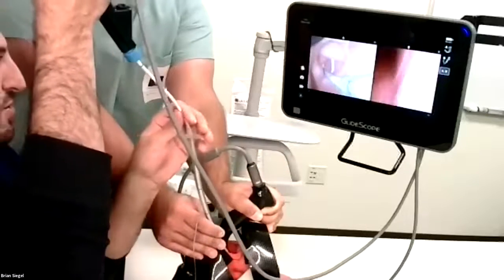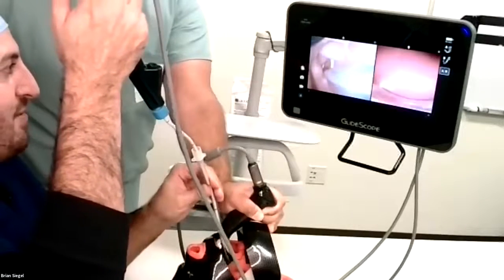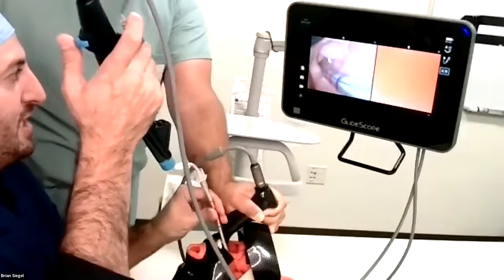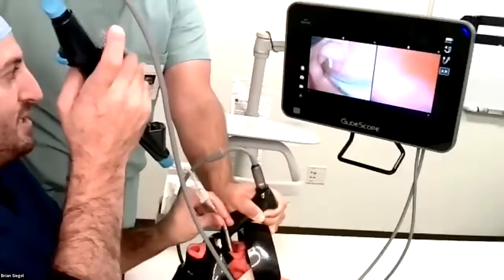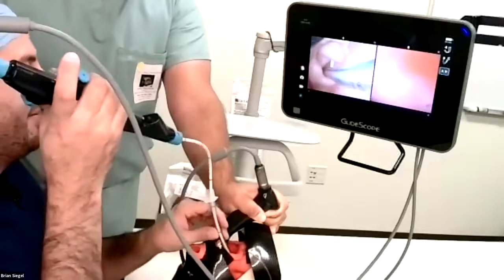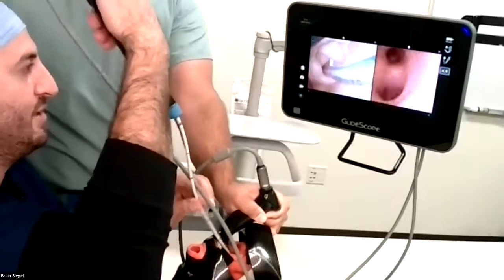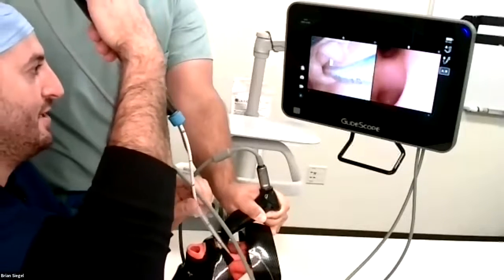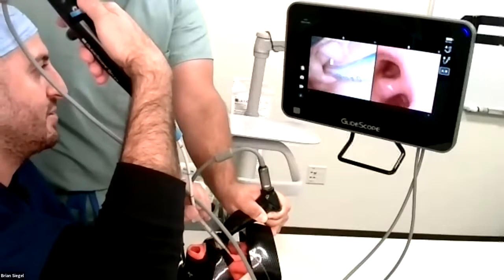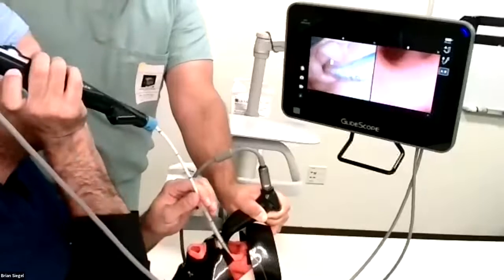Now that I'm through the cords, I'm going to take the tube from my assistant and advance it. Once I get to the cords, I'm going to use a twisting motion to just get it gently through the cords. Once it's there, I would inflate my cuff. Then if I wanted to, I could continue with a bronchoscopic examination of the lungs, the trachea, or whatever. You can see the image quality here is great, which is just another reason why I like this scope.